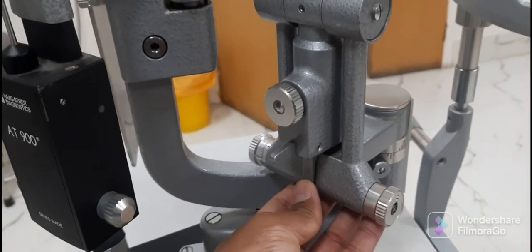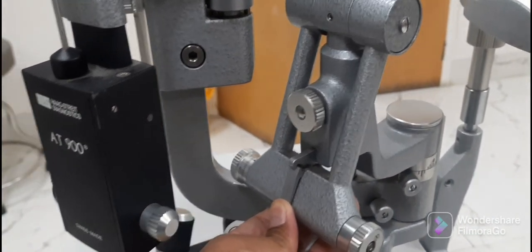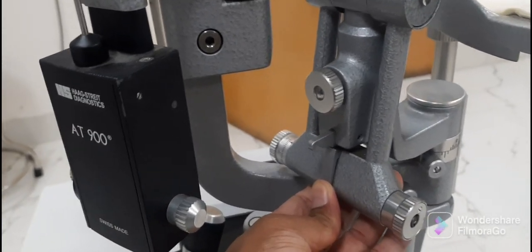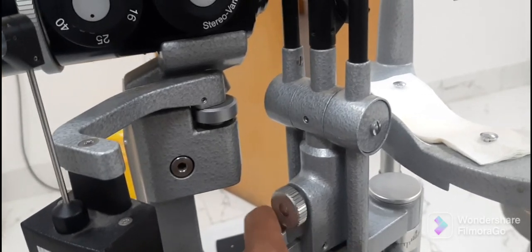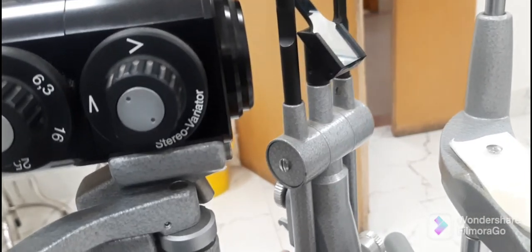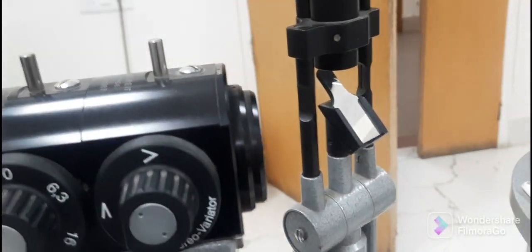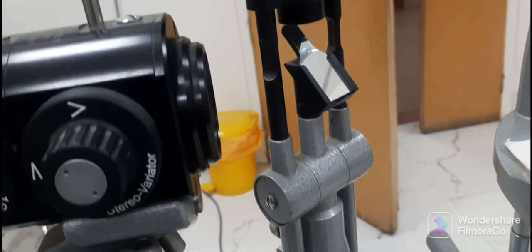The bottom lever is used to incline the whole illumination arm, as discussed earlier — it has three steps. This knob is used to adjust the illumination arm slightly in the right and left direction during posterior segment examination for better enhancement.